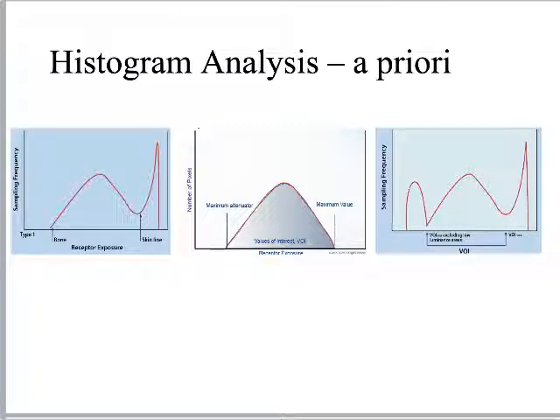That's barium, right? That funny little bell-shaped curve on this histogram is barium. I do not need to include barium in my picture, right? I'm not interested in barium. It's just going to be purely white, right?